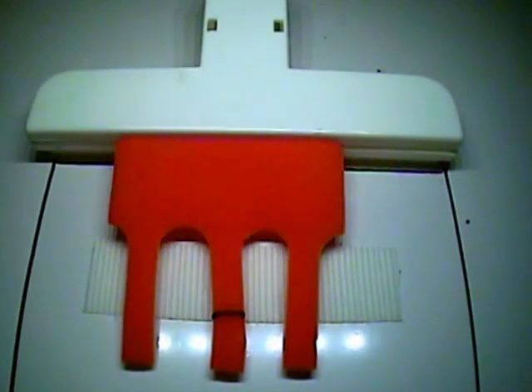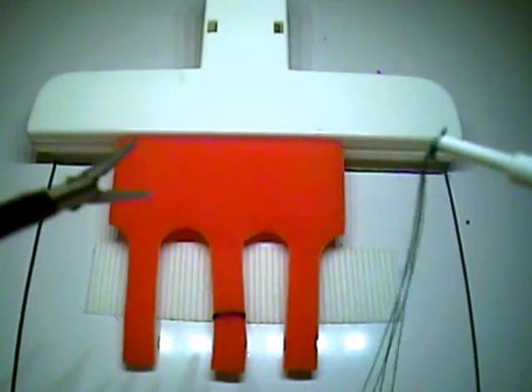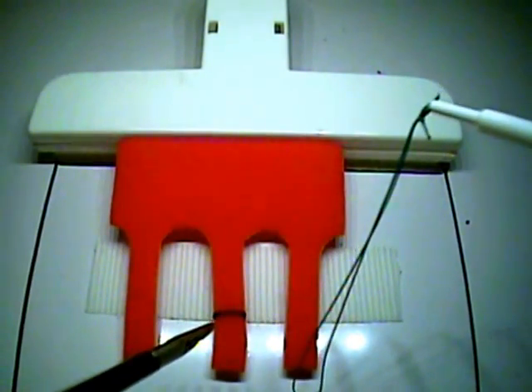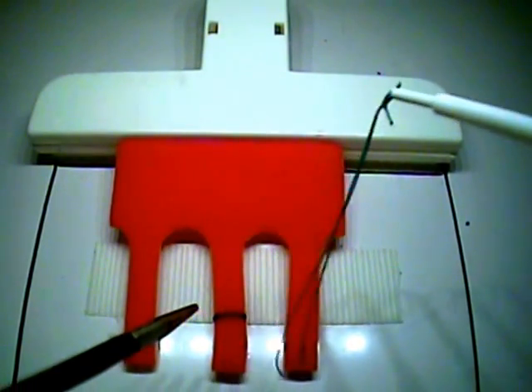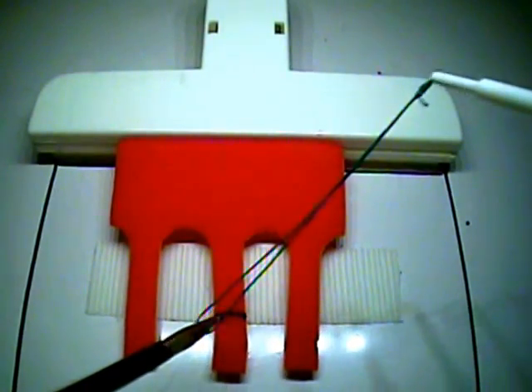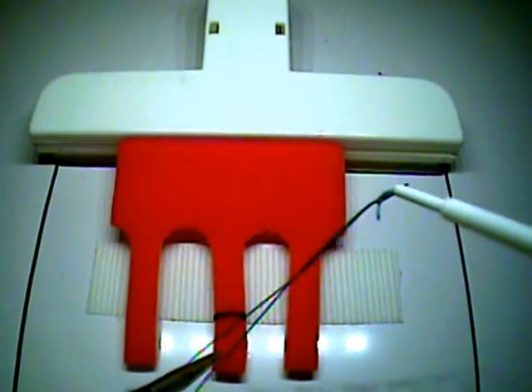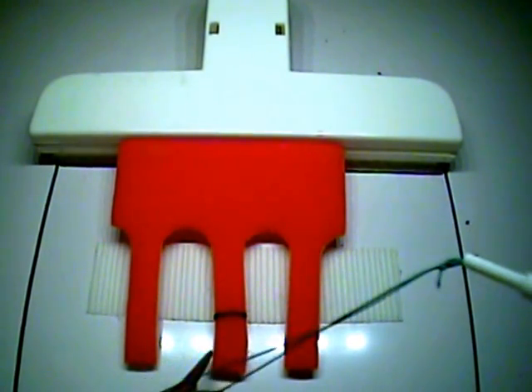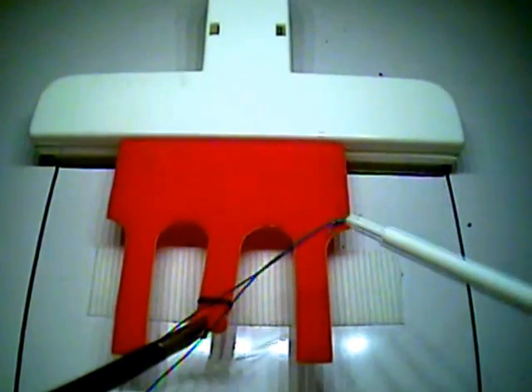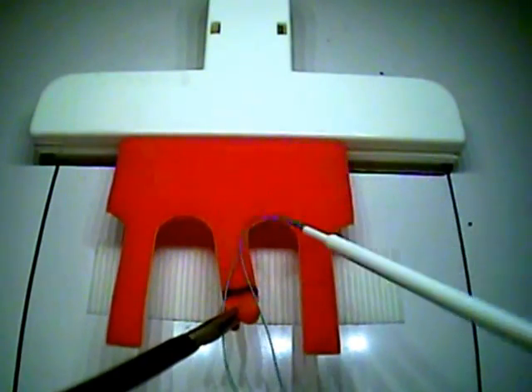Task number three: the ligating loop. For this task, you're given a locking grasper and one loop, and the stitch will be cut with a pair of scissors at the end of the exercise. The goal is to place the ligating loop on the target structure within one millimeter of accuracy of the black line. The loop can be tightened with either a one-hand or two-hand technique, but we recommend tightening it with one hand so that the other hand maintains control of the locking grasper.